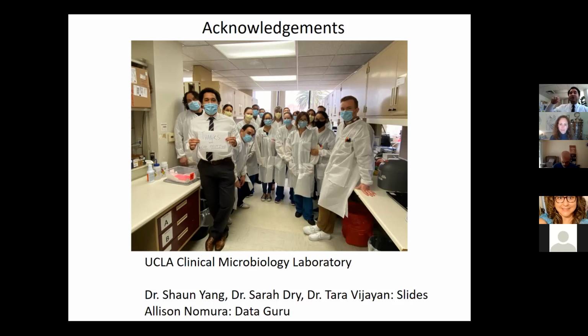At the same time, there's a reporting mechanism to public health, and that's going to depend on the lab's relationship to public health. My lab, as an infectious disease diagnostic lab, is integrated directly to public health by computer. What that means is every time I have a result come out, that result is automatically transmitted to LA County Public Health to be included in that day's data. Now, everybody doesn't have this connection. If the lab testing doesn't have that connection to public health, they may be faxing results over, and there may be delays then in that result landing at public health.